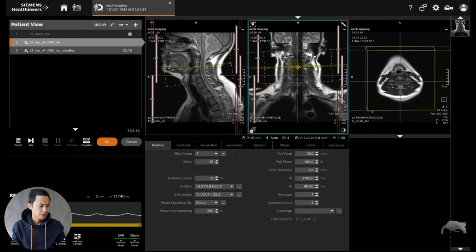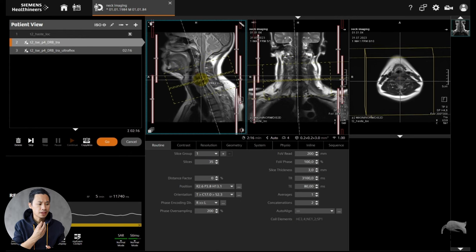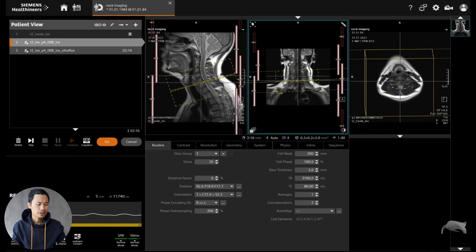Let's scan that one. I just did a transversal plane to test it out in front of the neck. In the back we know that the cervical spine should work with the standard coil setup, but in the front of the neck sometimes it can be difficult to highlight that area. So we're going to test it out.